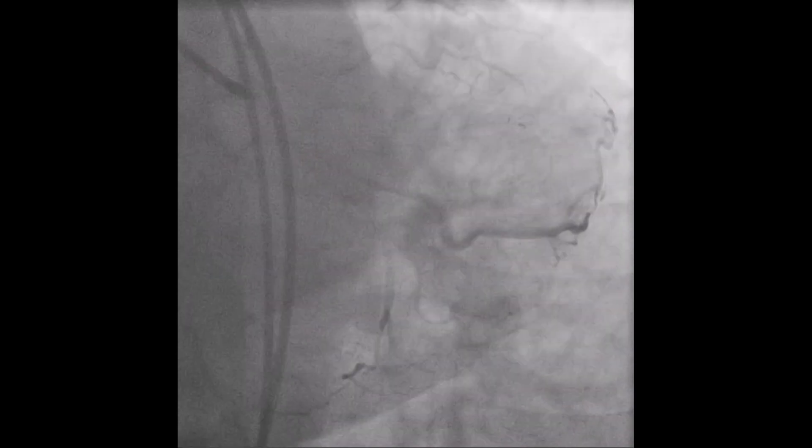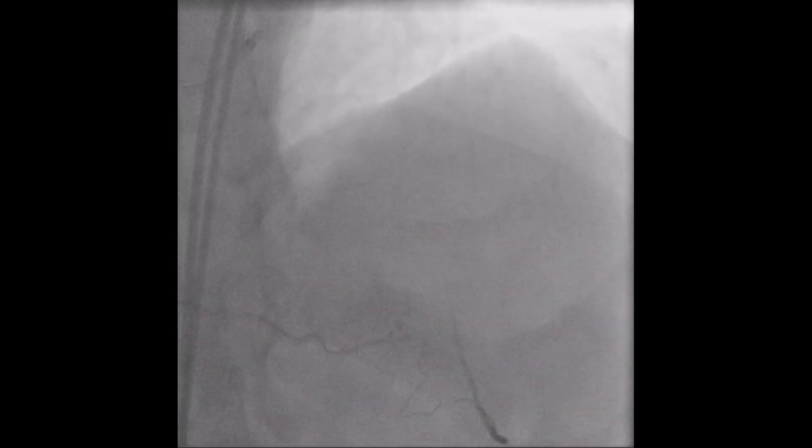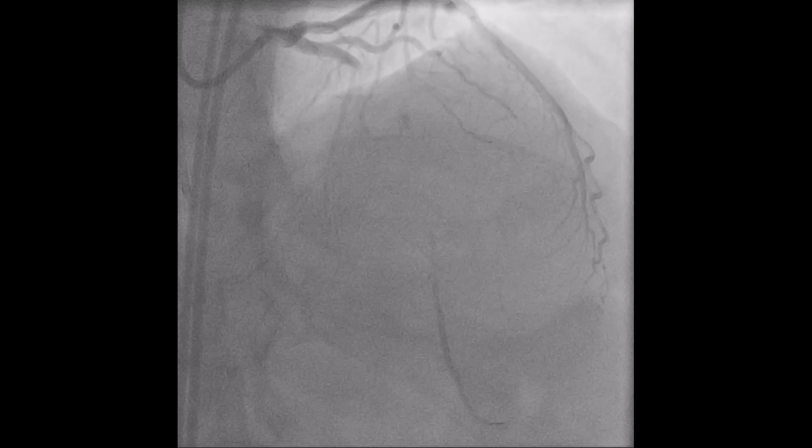The angio shows a totally occluded mid-LAD artery. Dual injection in apicranial view identifies the situation. The LAD receives blood flow from epicardial collateral from the distal RCA, and there is also some ipsilateral collateral flow supplying the artery near the distal cap. The stump is blunt and there is a septal branch nearby. The lesion length is less than 20 mm and there does not appear to be much calcification.